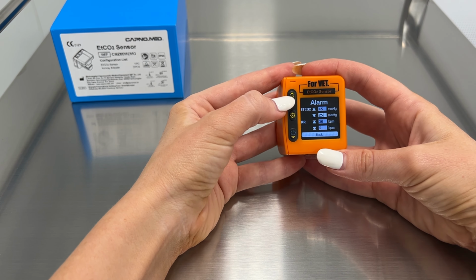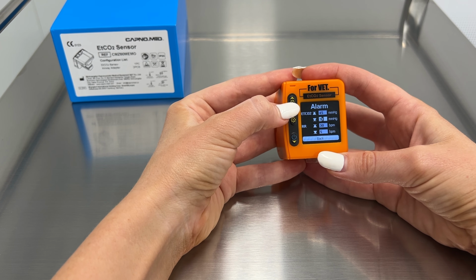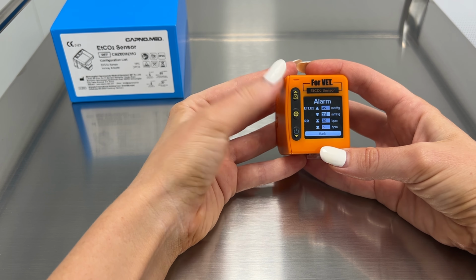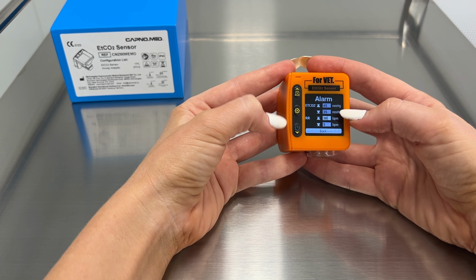And I'm going to go up with this one. I'm going to go up to, down, select. I'm going to go up to 35. And menu button again to select. Respiratory rate, let's change that. Respiratory rate high, that's okay.